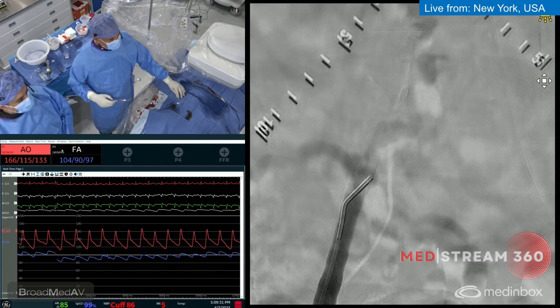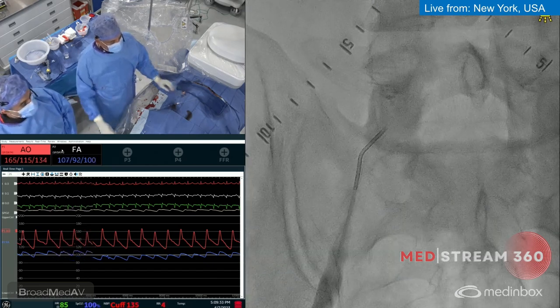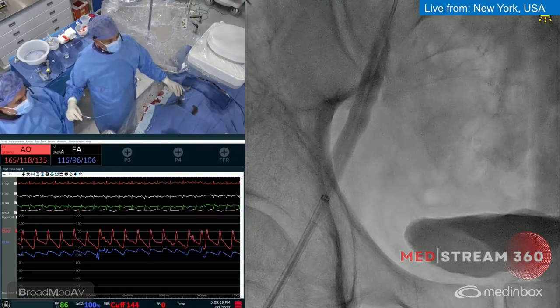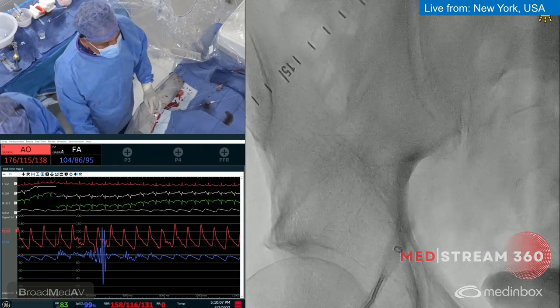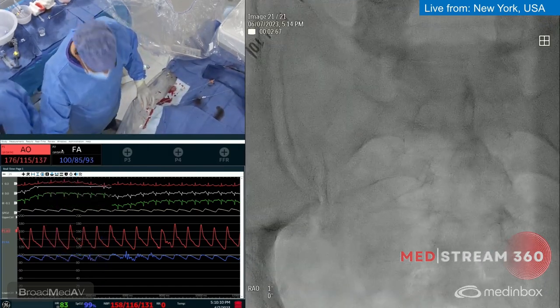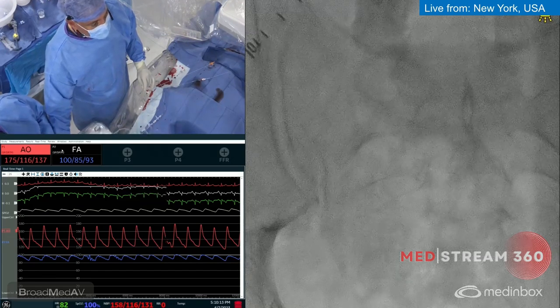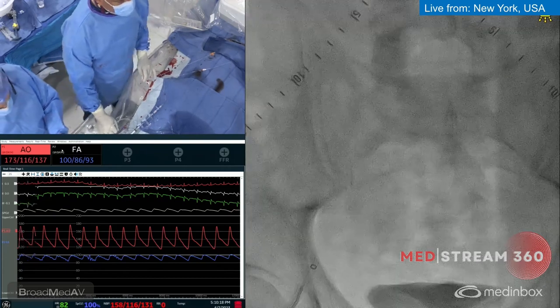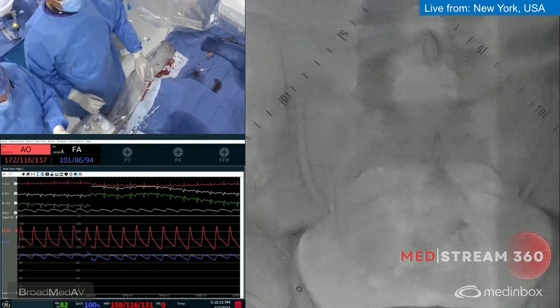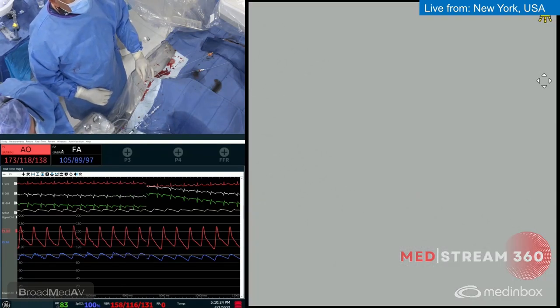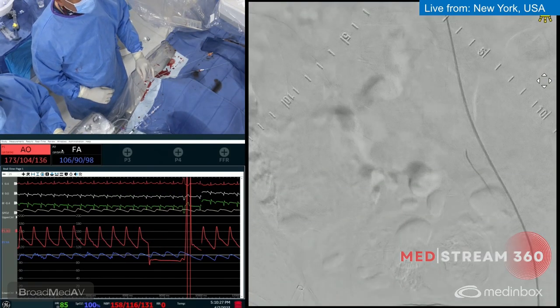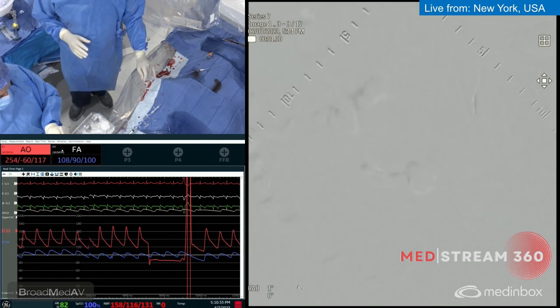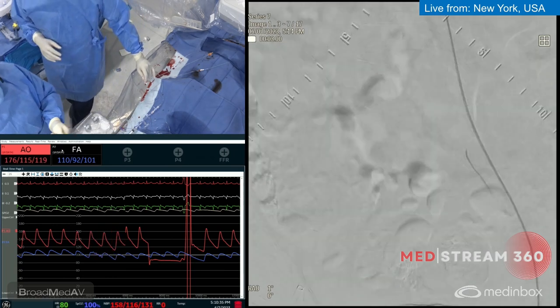It looks like a blunt, flush occlusion, but there's a little stagnation — the question is whether I've dissected with my catheter. The best approach now is to diagnose the mechanism by default, since we don't have a history of dissection. This patient has had numerous cardiac caths, so it may have been dissected during one of those. We're taking a picture from above to see whether there's still flow in the internal iliac. There is flow in the internal iliac — so this is likely a dissection.